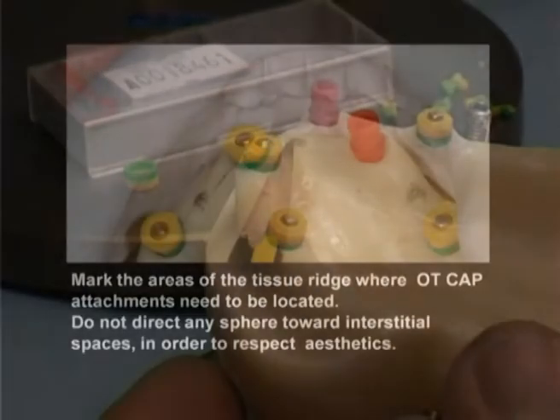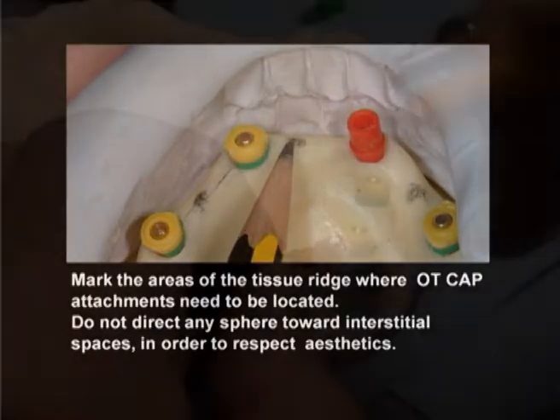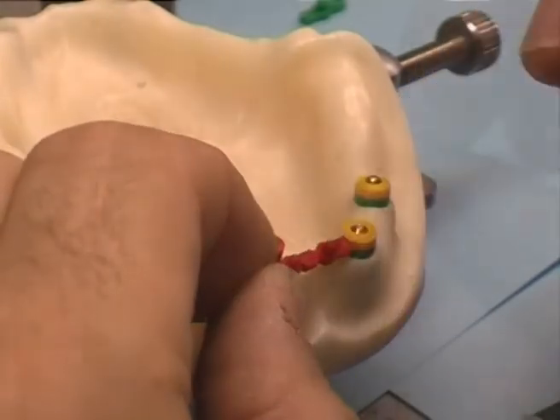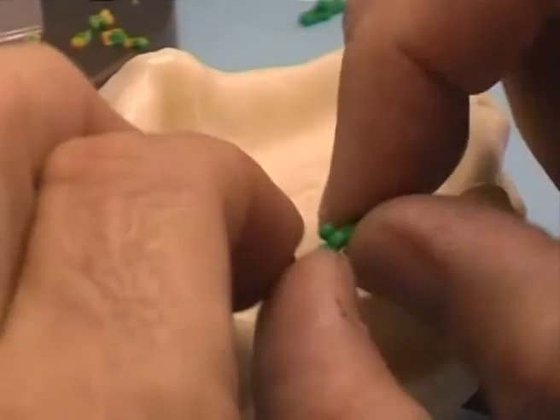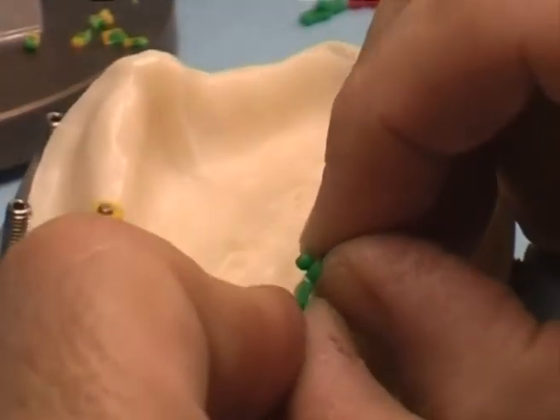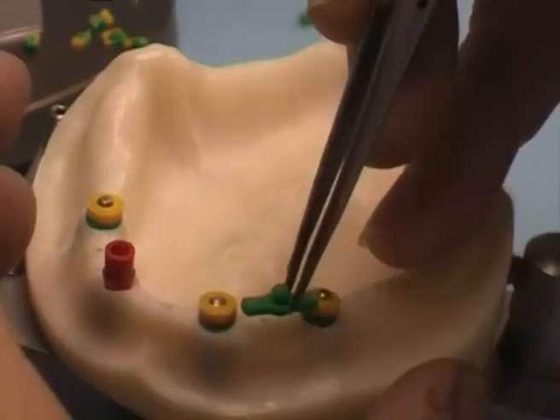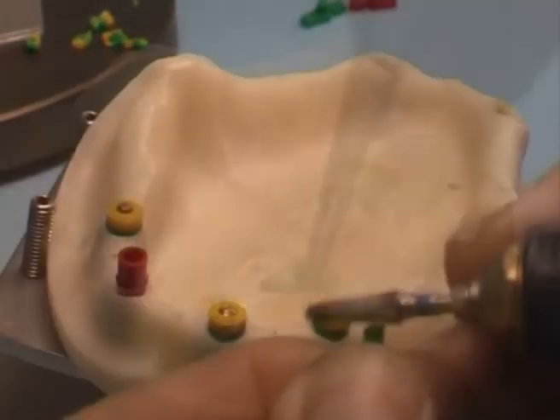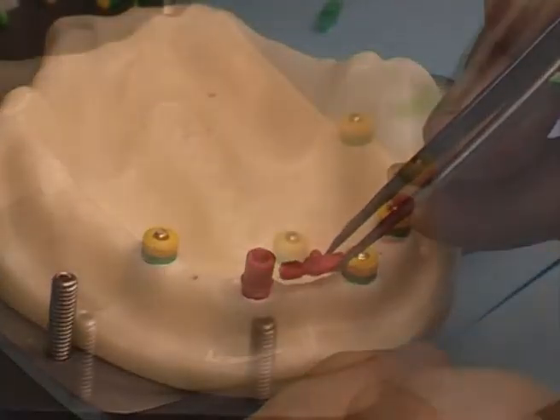Using the trial mask, mark the areas of the tissue ridge where OT cap attachments need to be located. Do not direct any sphere towards interstitial spaces in order to respect aesthetics. Cut OT cap bars with spheres, getting enough length. Insert them in between the boxes until the whole main passive structure is completed. It will be cemented to the implants in the mouth after casting.